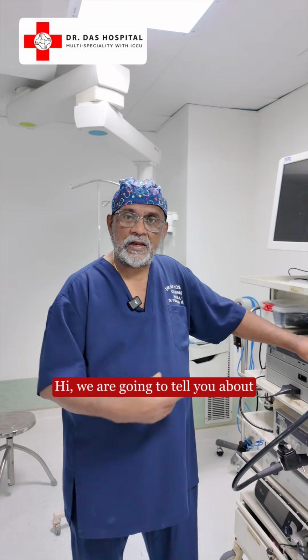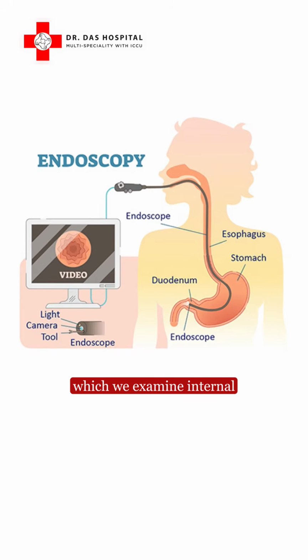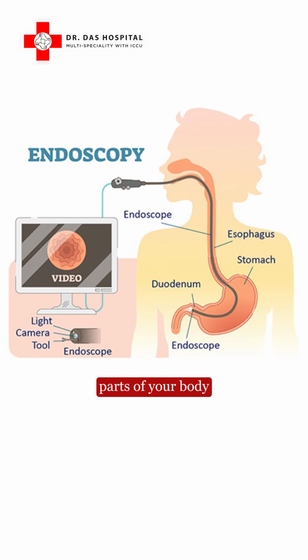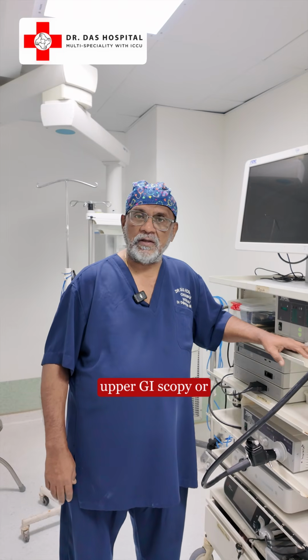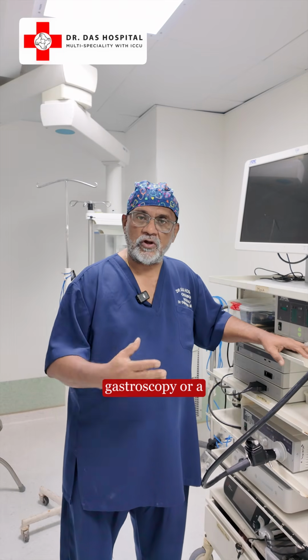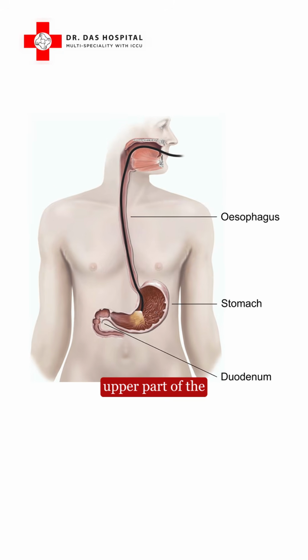Hi, we are going to tell you about endoscopies in GI surgery. Endoscopy is a device by which we examine internal parts of your body without any cuts. We do what is known as an upper GI scopy or gastroscopy or a gastroduodenoscopy. This is the way we come to know any defect in the upper part of the alimentary tract.